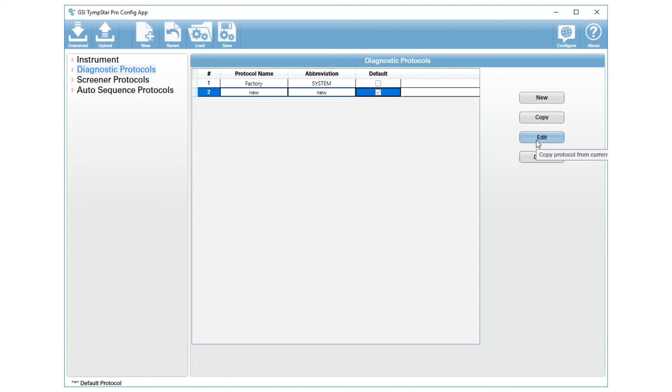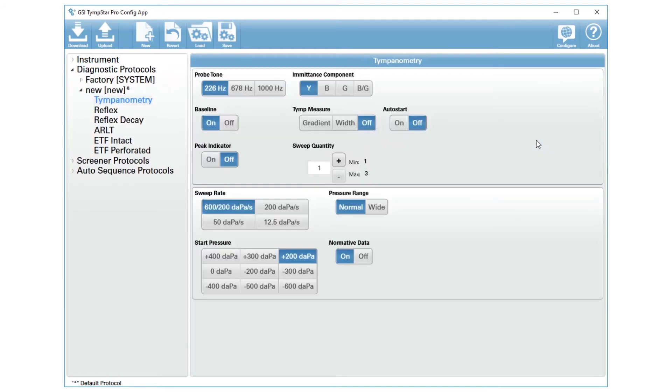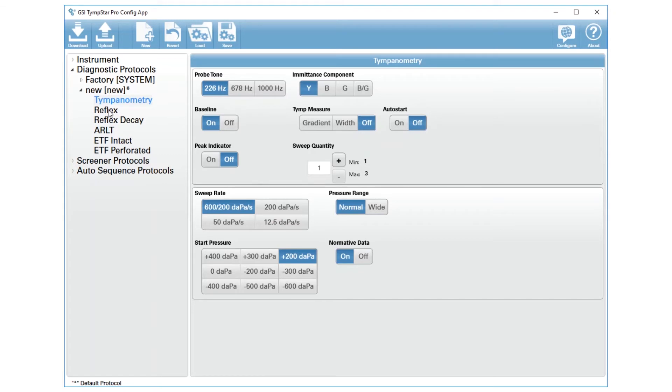Then you can move into the edit button. When you go to edit, you will notice over here on the left side that tree has expanded, and it gives you options for each one of your tests. The test we're talking about is reflex, so we will go there.